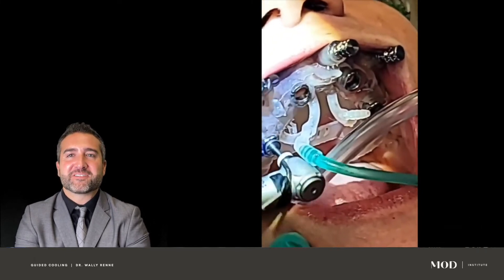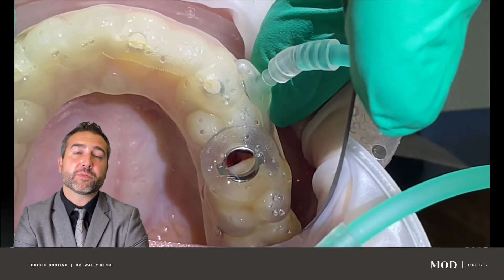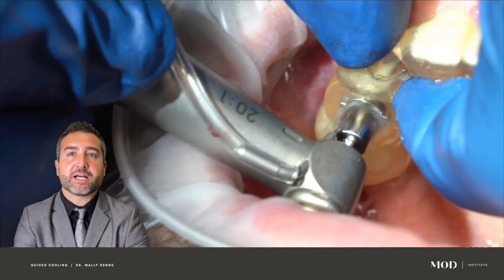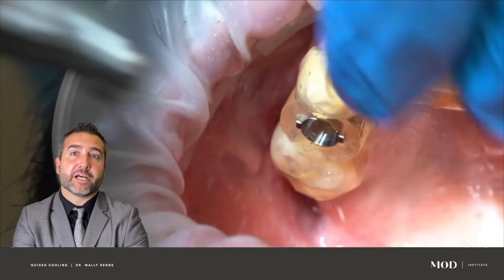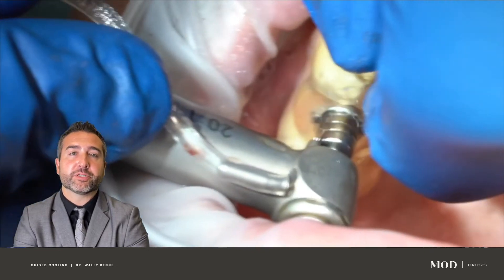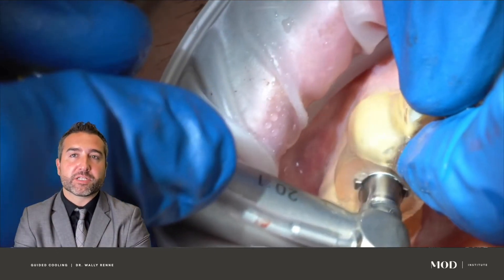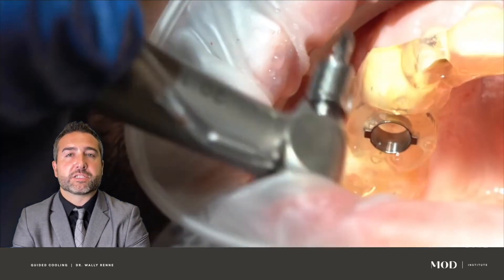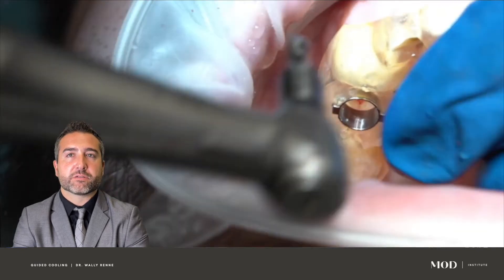We're going to go through how we create these ports into our surgical guides and 3D print them, so we can hook up the irrigation tube — which normally hooks up to the handpiece — to the guide instead. As you can see here, when you use traditional irrigation through a drill, it all gets displaced onto the guide and off of the osteotomy site. It just sprays everywhere; it doesn't really get down into the sleeve or, more importantly, down into the bone or onto the drill as it's drilling the cortical plate.